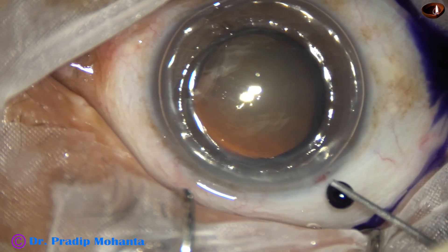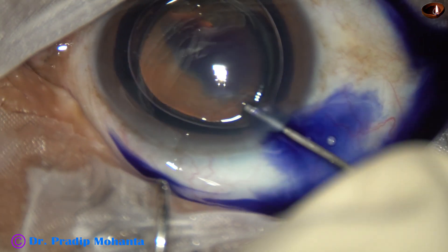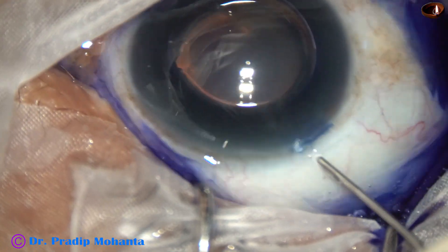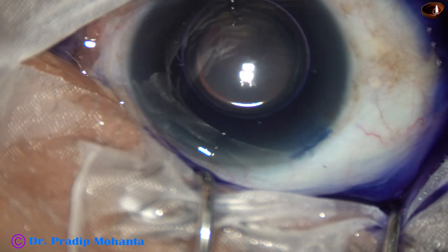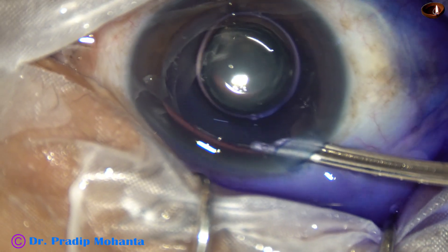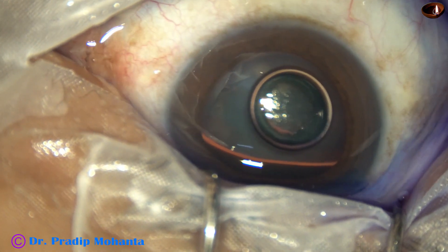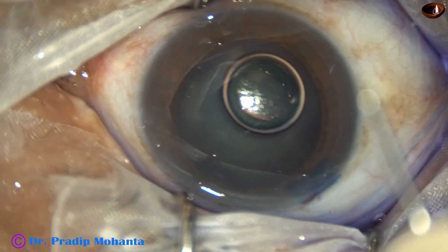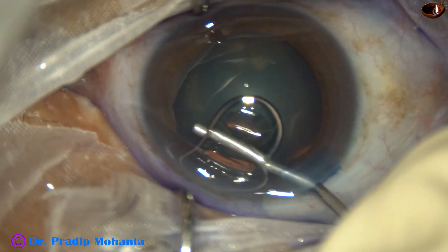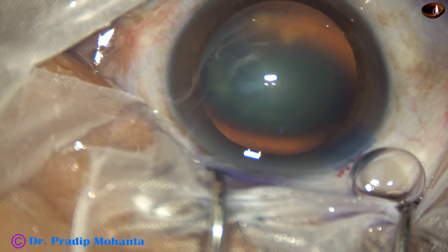An air bubble has been injected into the anterior chamber. Trypan blue dye is applied over the anterior capsule, and then you see a little bit of adrenaline, and then the dye is washed out. Now the anterior chamber is filled up with 2% hydroxypropylmethylcellulose.